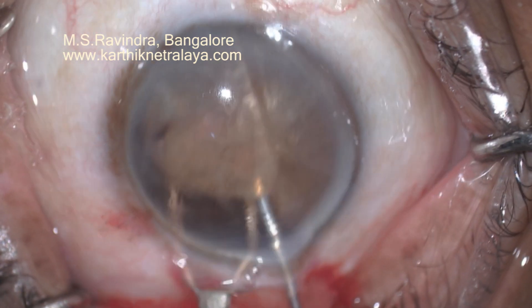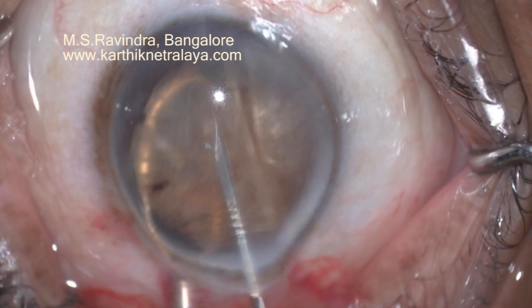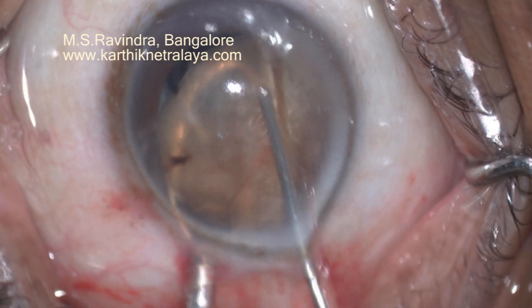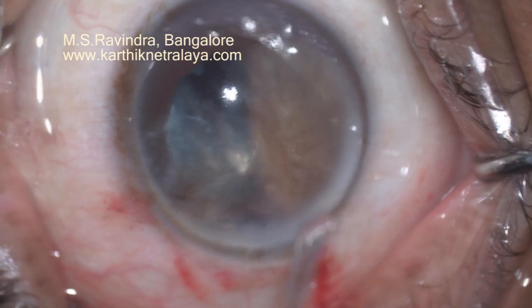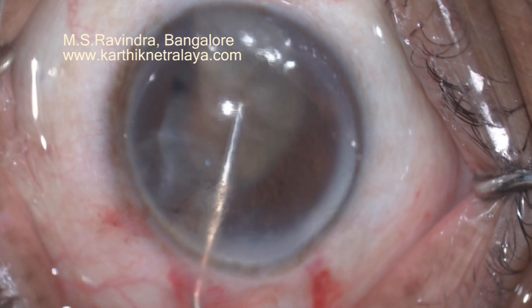It can be easily bisected in the anterior chamber, protecting the endothelium with frequent injection of viscoelastic. The nucleus is removed using a special microvectis. The anterior surface of the nucleus is made parallel to the cornea so that no part of it rubs against it. It's a single tunnel.